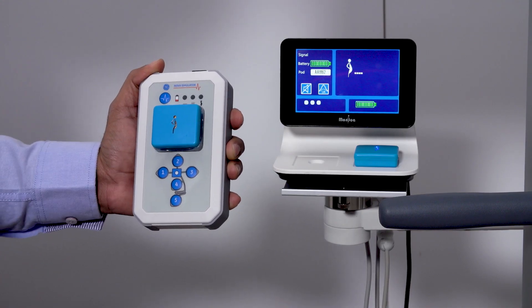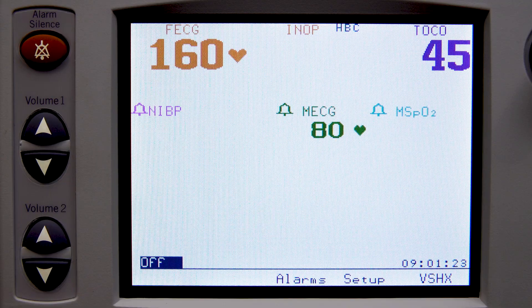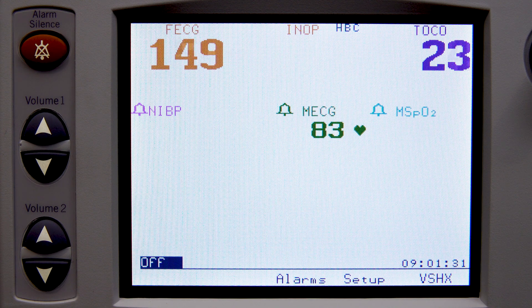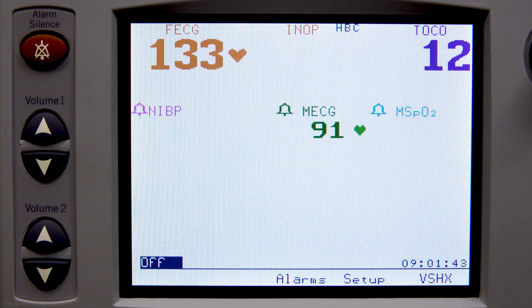Similarly, the variable mode simulates maternal heart rate, fetal heart rate, and uterine activity signals, but at changing rather than constant values in a sawtooth pattern. It shows a maternal heart rate of 80 to 100 plus or minus 3 beats per minute, fetal heart rate at 120 to 160 plus or minus 3 beats per minute, and a uterine activity of 0 to 50, plus or minus 10.